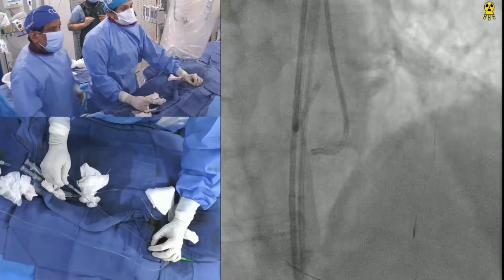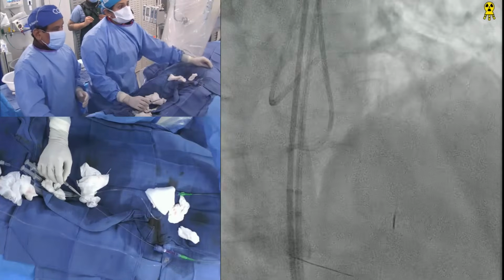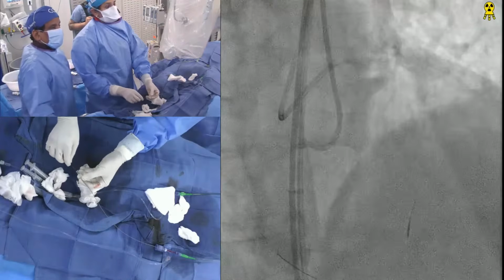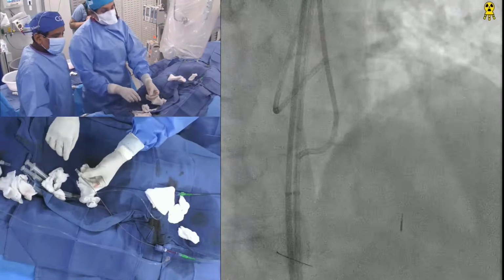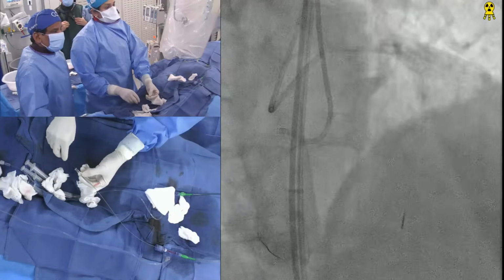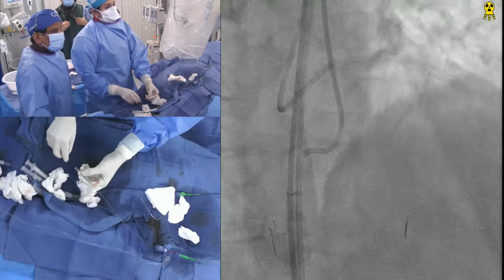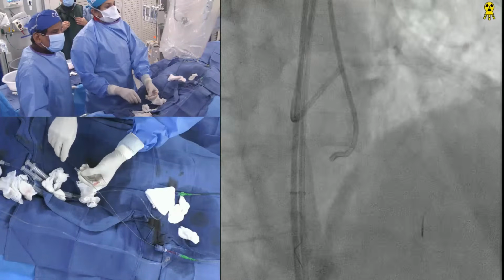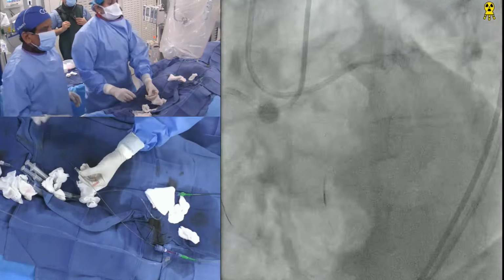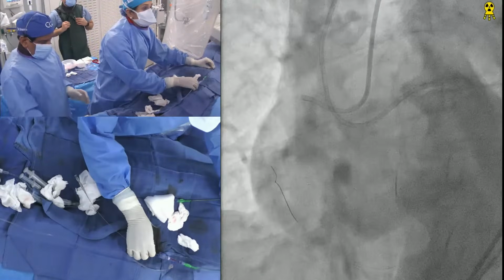Advance the wire more. But that's very interesting. The Turnpike made the turn when Corsair has a tough time. We have dilated also, with a 1.0. Dilated there, dilated proximally, all of them I think contributed. You want to go, Leo? Question is, is the caliber of this septal good enough? No, it's not making any more turn. Yeah, I want to advance.